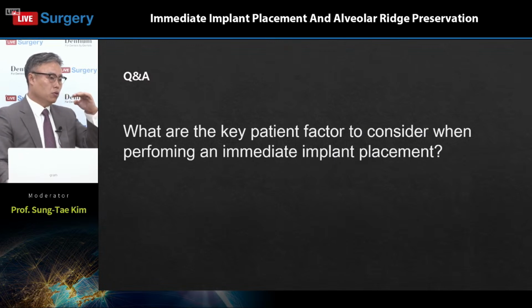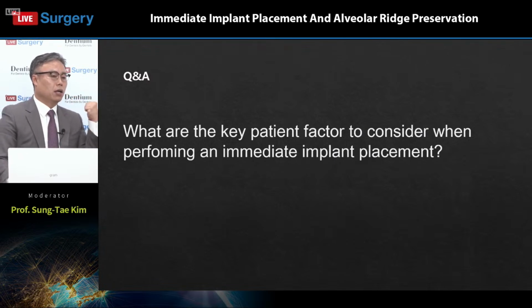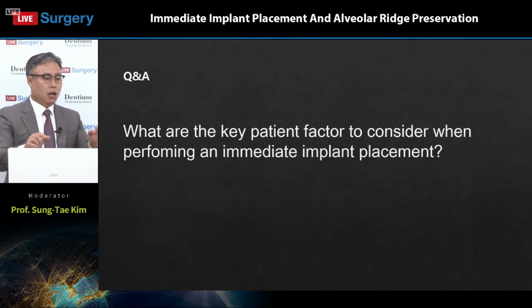If there's too much damage to the buccal plate, then we have to consider ridge preservation and placing the implant later, because we don't know how much bone loss there would be after healing following the tooth extraction.